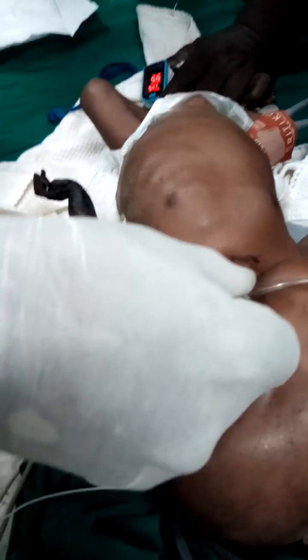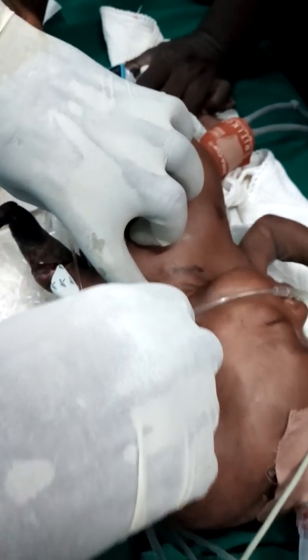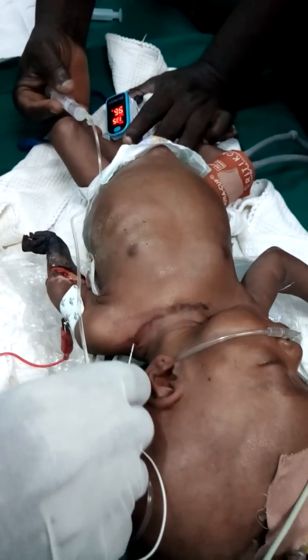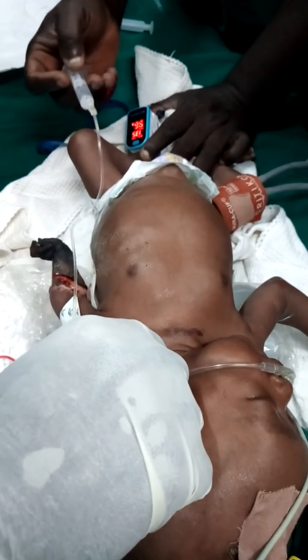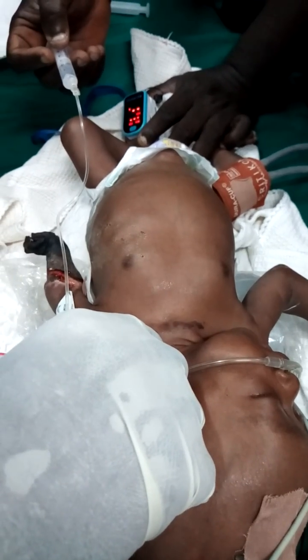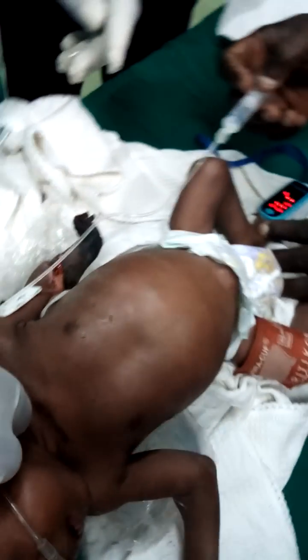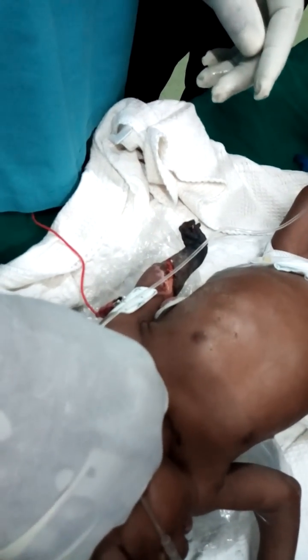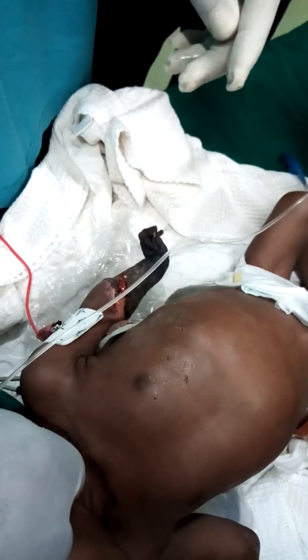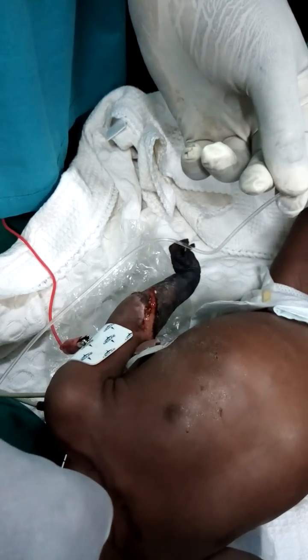Let's increase the current — let's get a good muscle response. Okay good, now reduce the current. Increase the current a bit. You're going to inject — inject everything, push it in. The assistant is now injecting the local anesthetic.